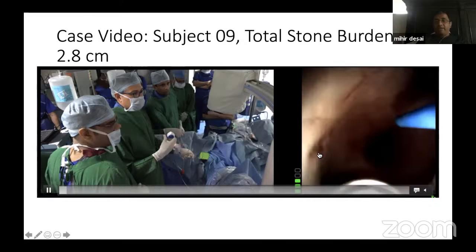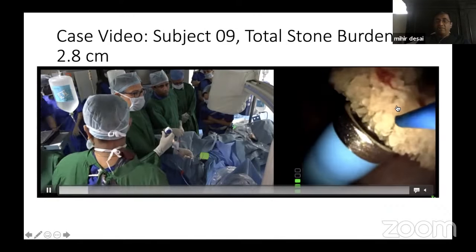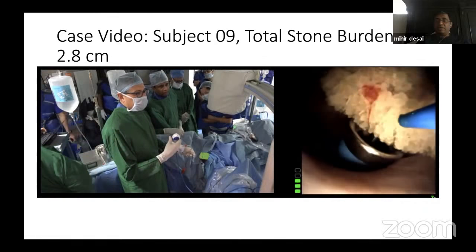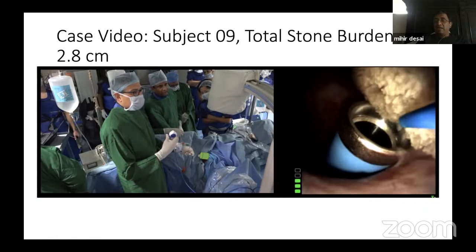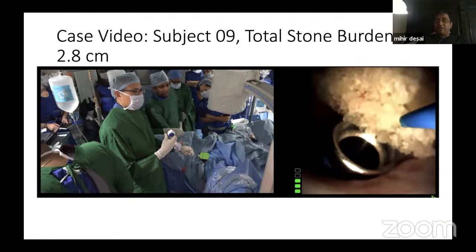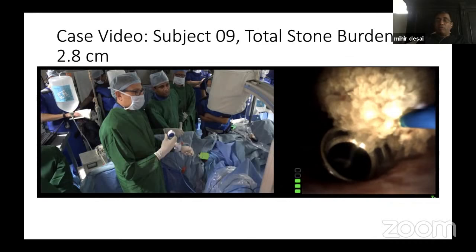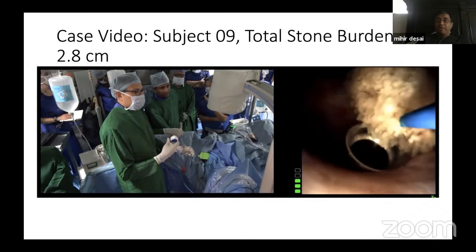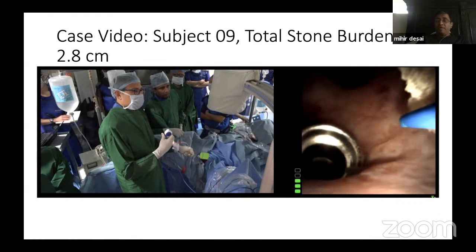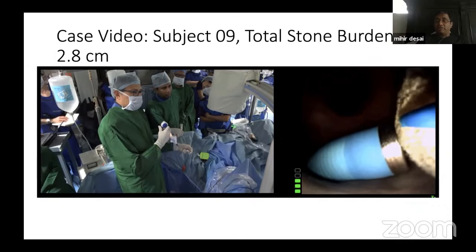And this is the intrarenal collecting system. You can see that this is excellent optics. This was a soft stone, and even using a low power laser, as the fragmentation starts, you can see that the fragments are immediately aspirated. Part of the advantage of suction on the percutaneous catheter is it also keeps the stone fairly static and less prone to moving around. In fact, we also used the percutaneous catheter to relocate stones into a desired location for fragmentation.